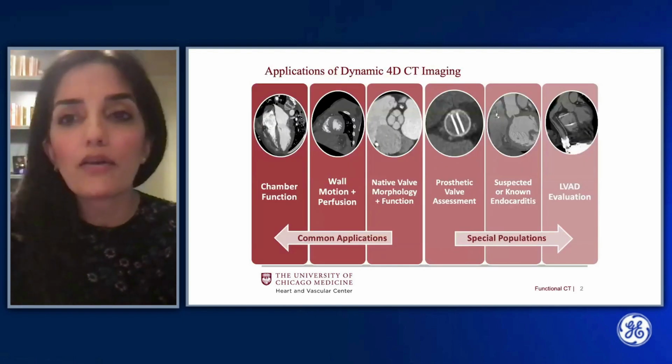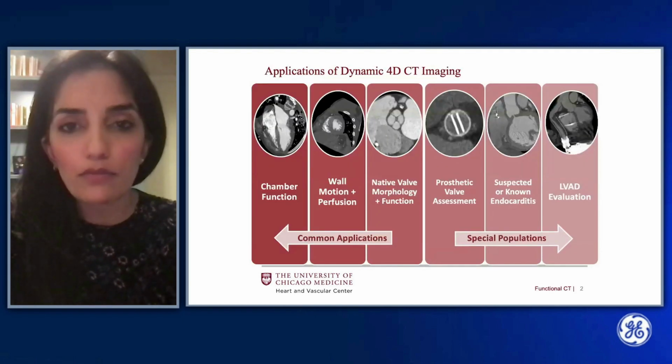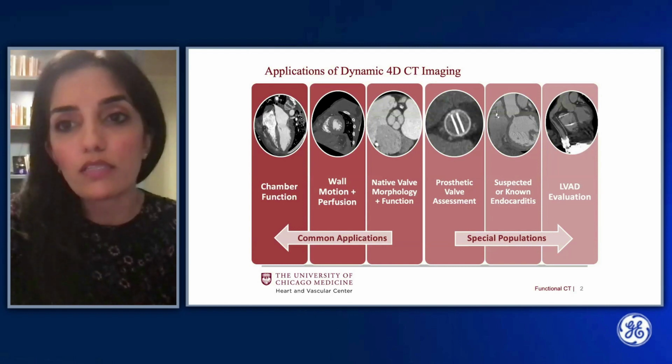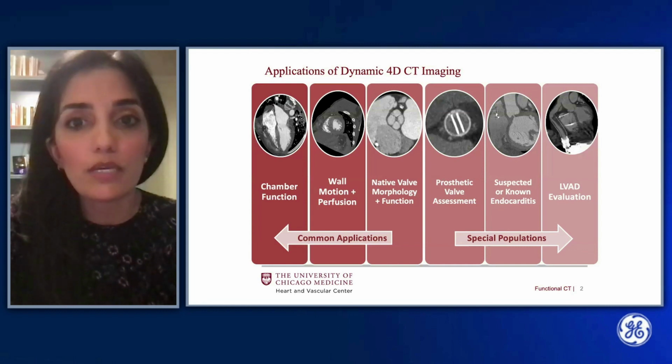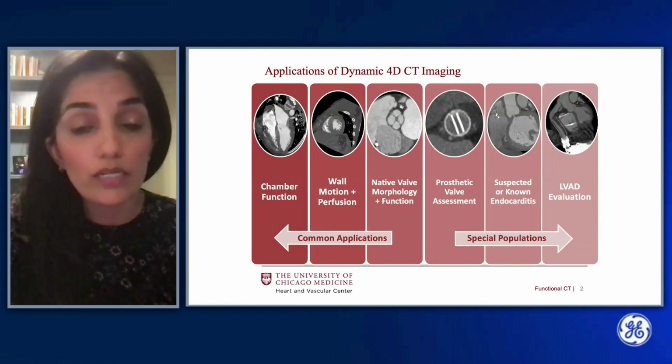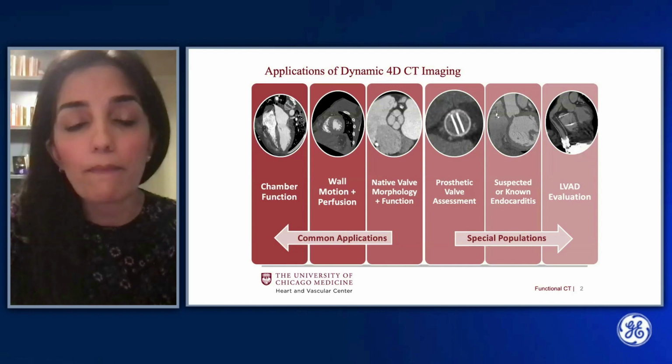We've long known the value of cardiac CT in the assessment of coronary disease and structural heart disease pre-planning, but another powerful application associated with this modality is the ability to acquire dynamic 3D data sets over time, referred to by some as 4D CT, with the additional temporal component enabling the evaluation of cardiac function, wall motion, and valvular assessment. These are all almost always relevant to clinical care.